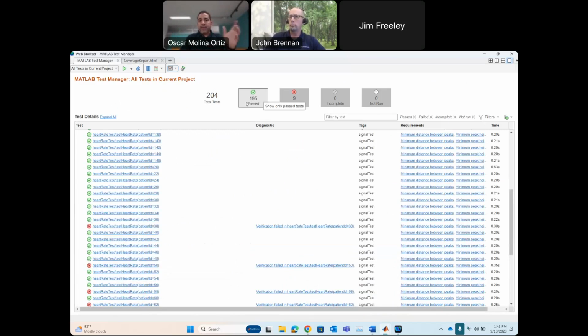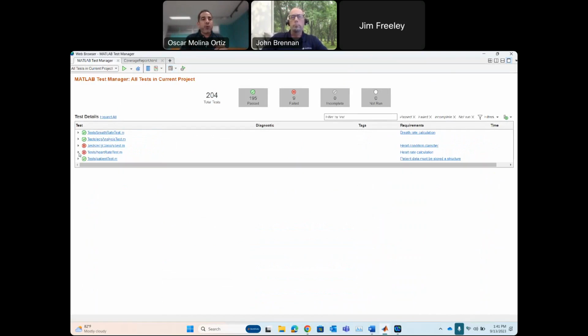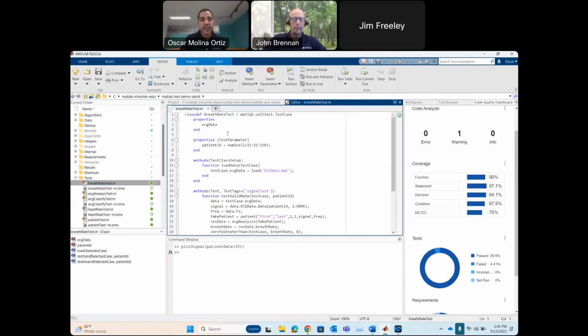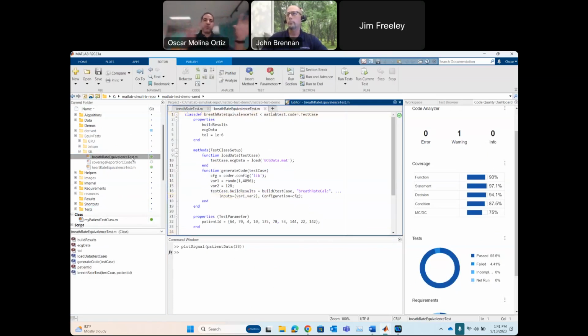Another thing to mention right here is that John mentioned equivalence testing, right? And equivalence testing is when we take this code. Actually, let me open up one of these tests, maybe the breath rate test. That could be a good one to look at. And then let me open up the equivalence testing version of it, and then I'll walk you through what that means for equivalence versus MATLAB testing.